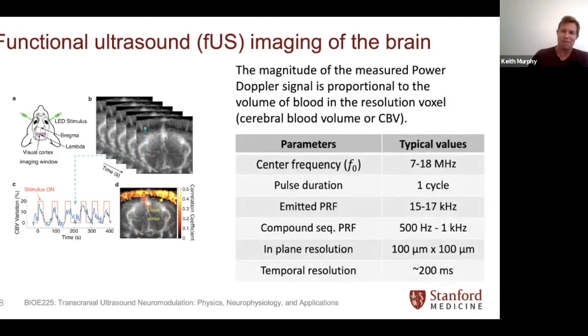Could you briefly orient us to the picture? Because you kind of zoomed in, and I can see the very black line at the top, meaning that's outside the animal. So you mean anyway, here?